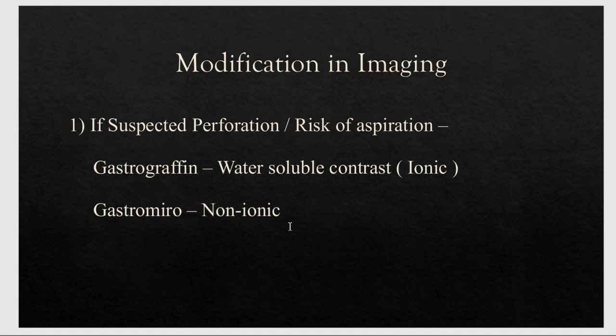How come? Very quickly we'll go through this. If there is suspected perforation or if there is risk of aspiration, don't use barium.